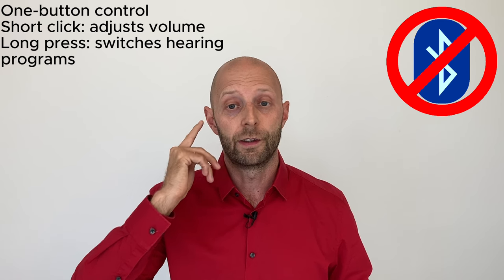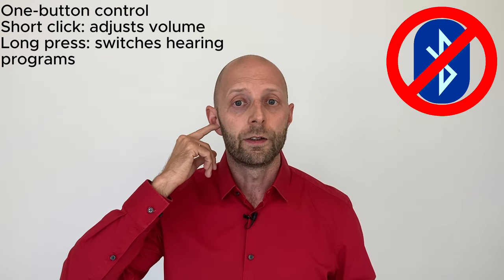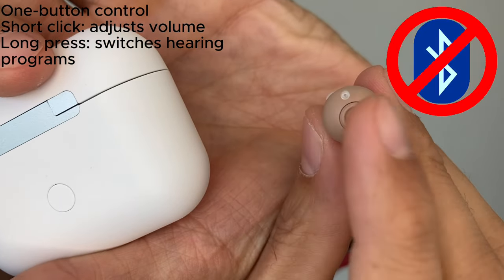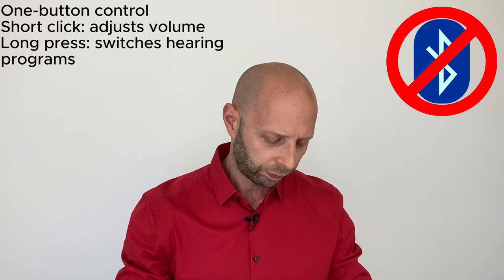These hearing aids do not feature Bluetooth and there's no smartphone app — you don't need it. A short press adjusts volume and a longer press of three to four seconds switches the hearing program. One thing to note: when inserting the hearing aid, you'll unavoidably press the button several times, so you'll need to readjust the program and volume each time. But the large button is a good thing — it's easy to find and push.